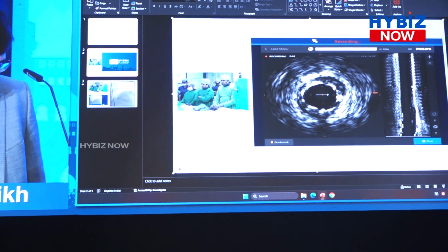Now this is inside the stent, a lesion is there. There you can go with just beyond the stent. Distal edge of the stent. But this is where the normal segment is. Then maybe you can come a little distal to that. Still you can come. Beyond the stent. Still beyond the stent. That is inside the stent. You can come.